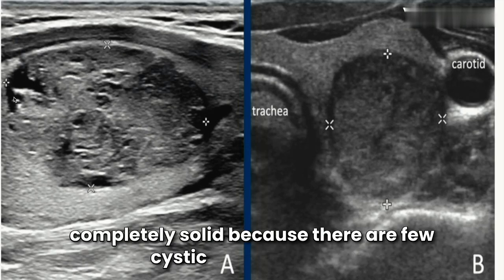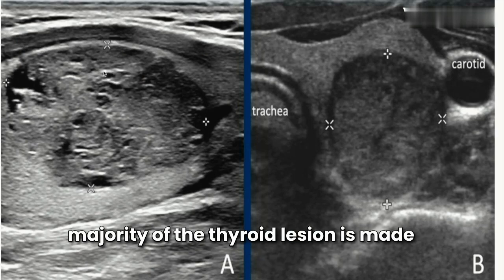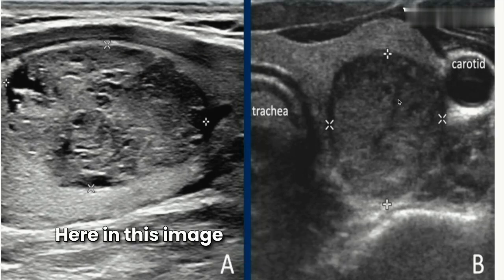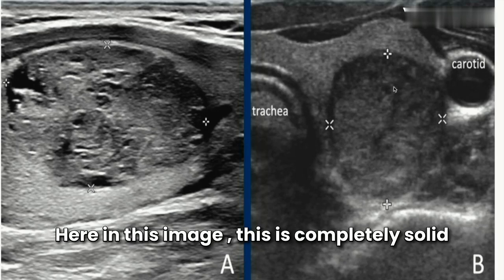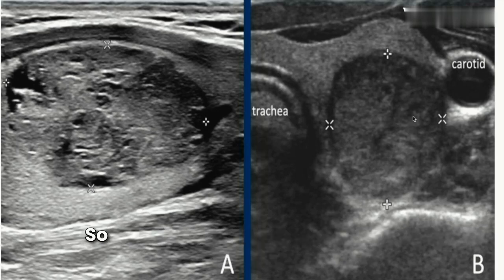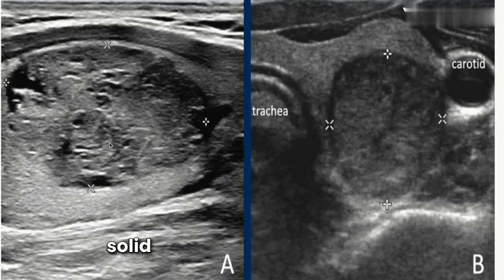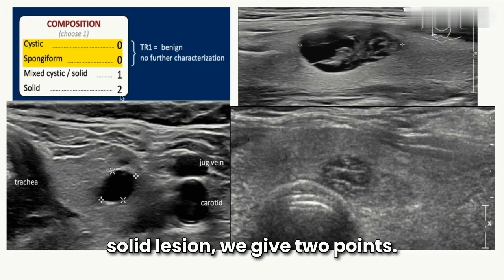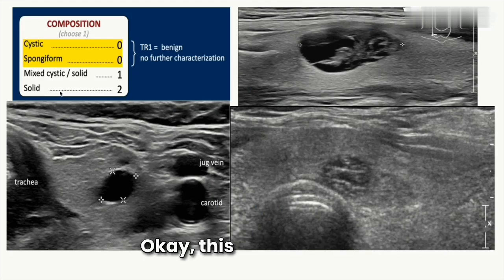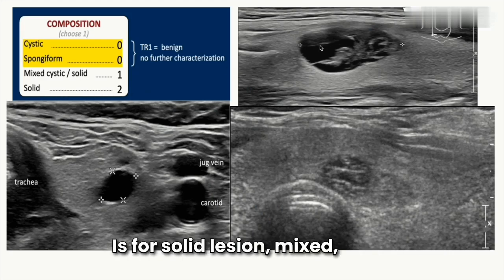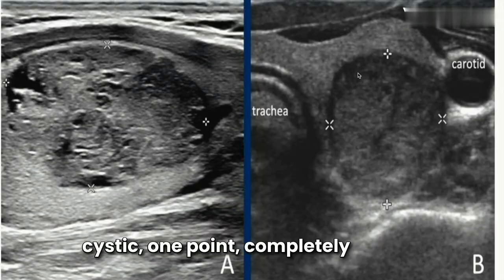In this image we can see an almost completely solid lesion — there are a few cystic spaces, but the majority is solid. In this other example, the lesion is completely solid. A completely solid or almost completely solid lesion scores two points. To summarize: solid lesion = two points, mixed solid and cystic = one point.